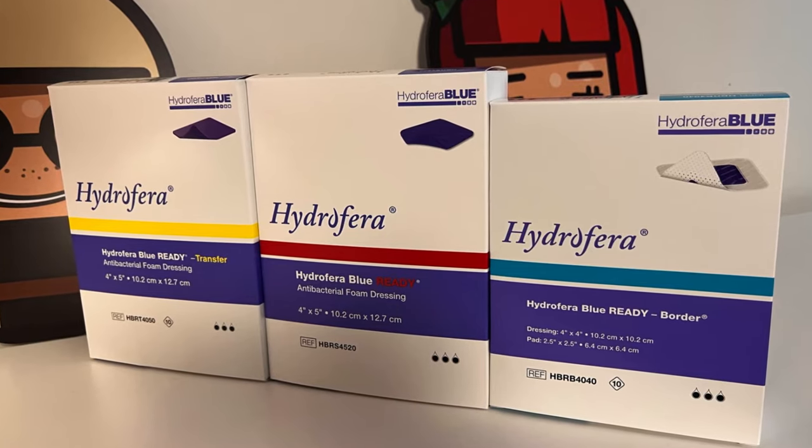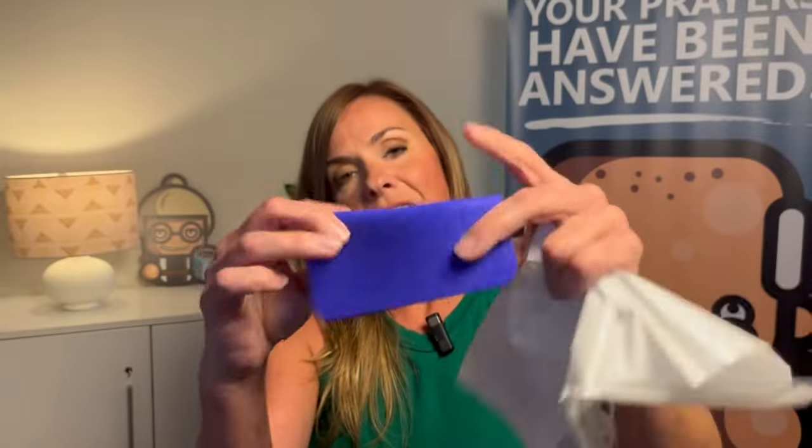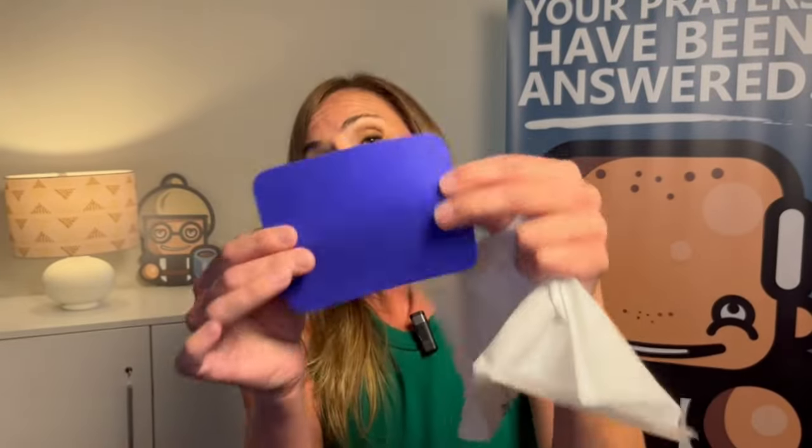You can cut this if you need to, to fit your wound bed or your wound shape. For our purposes, we're just going to show you what these look like and what they feel like. This is a really soft sponge. It's interesting because the Classic needs to be hydrated — this isn't hydrated, it's just soft.